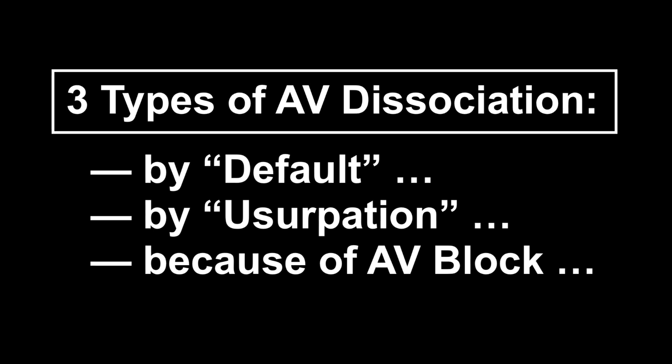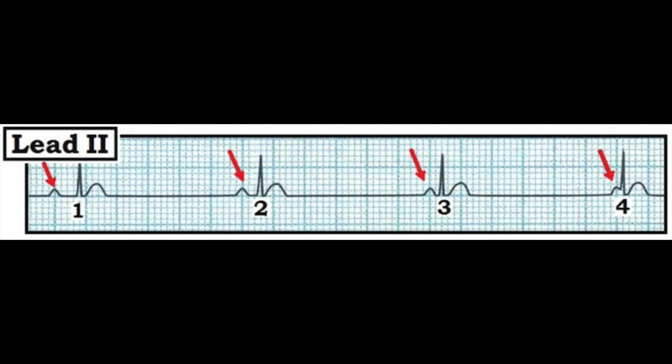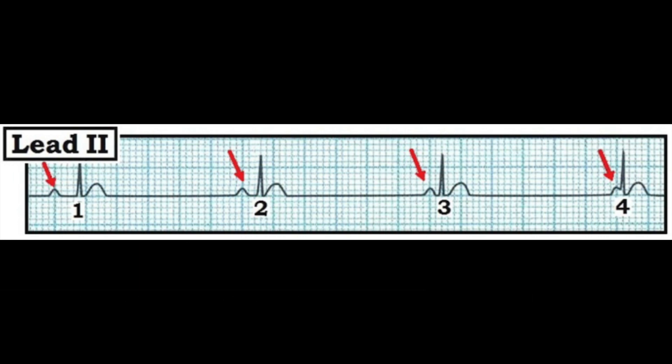There are three types of AV dissociation. First: AV dissociation by default. Because the sinus pacemaker — the SA node — slows down, the AV node may take over. This was a healthy individual put under anesthesia, which often slows the rate. The rate of the AV node is about 55; the sinus rate is about 50. What happened was sinus bradycardia, so a normal AV nodal escape pacemaker took over. This is AV dissociation by default. If you only showed me this rhythm, I would say there is no evidence of any AV block.